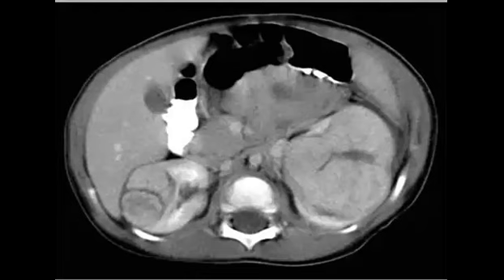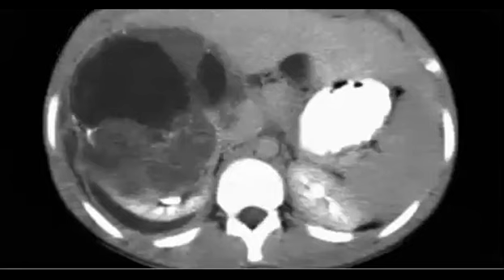Okay. On CT or MRI, the claw sign. The most important thing we mentioned is to comment on the IVC and the renal vein. Don't forget this comment. Also the relationship with the ureters and pelvicalyceal system. This one is not very common, but it will be one of the differentiations.